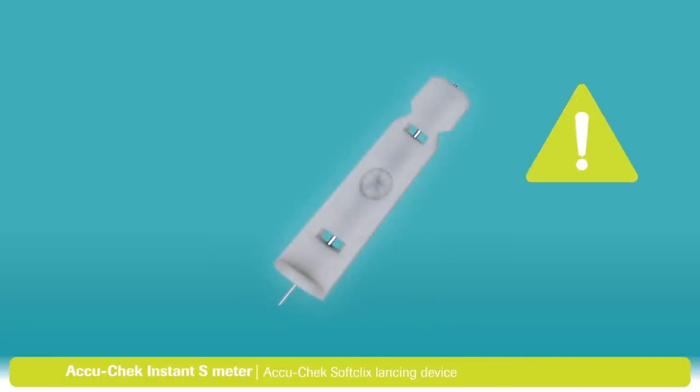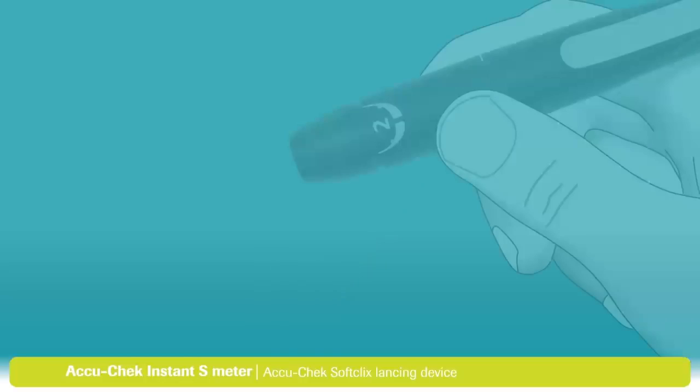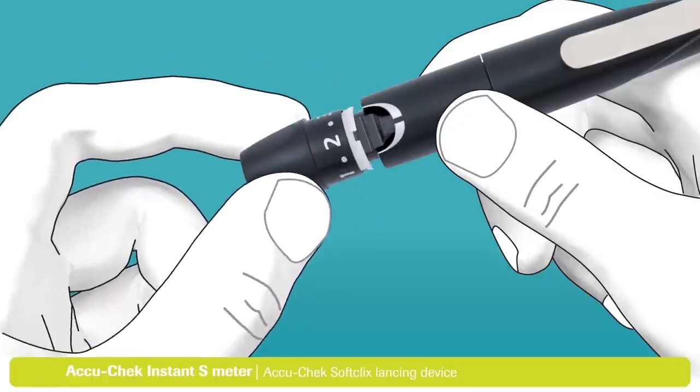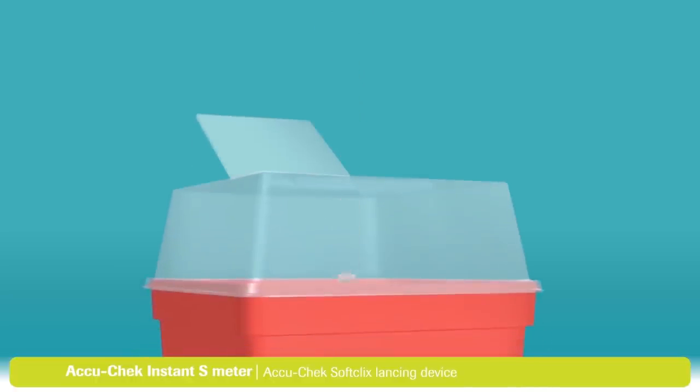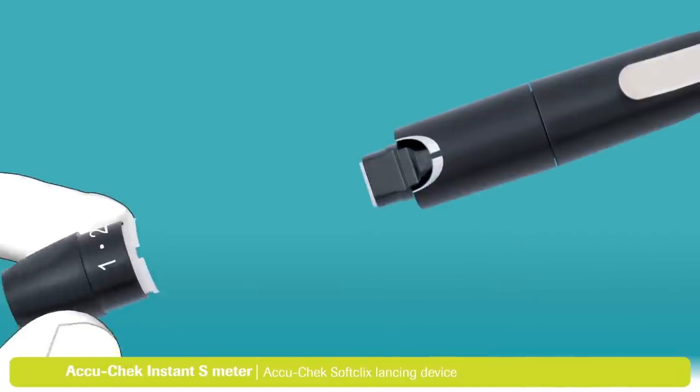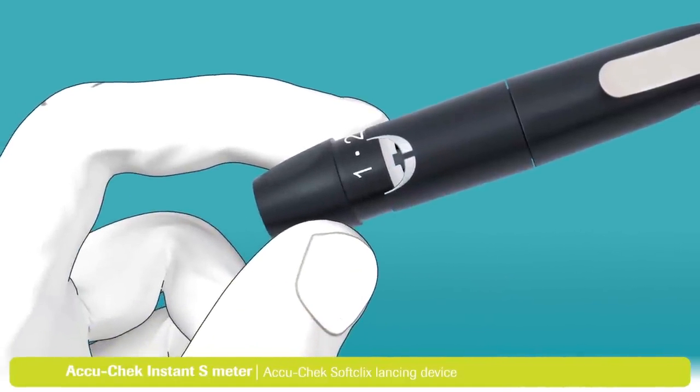This part is important. The AccuCheck SoftClicks lancets are disposable and should only be used one time. A reused lancet is no longer sterile and will lose its sharpness and become more painful each time you lance your finger. When disposing of a lancet, always make sure that it cannot cause injury and always use a sharps container. To dispose of the lancet, remove the cap from the lancing device. Point the lancing device into the sharps container and eject the lancet by sliding the ejector forward as shown. Then put the cap back on the lancing device.